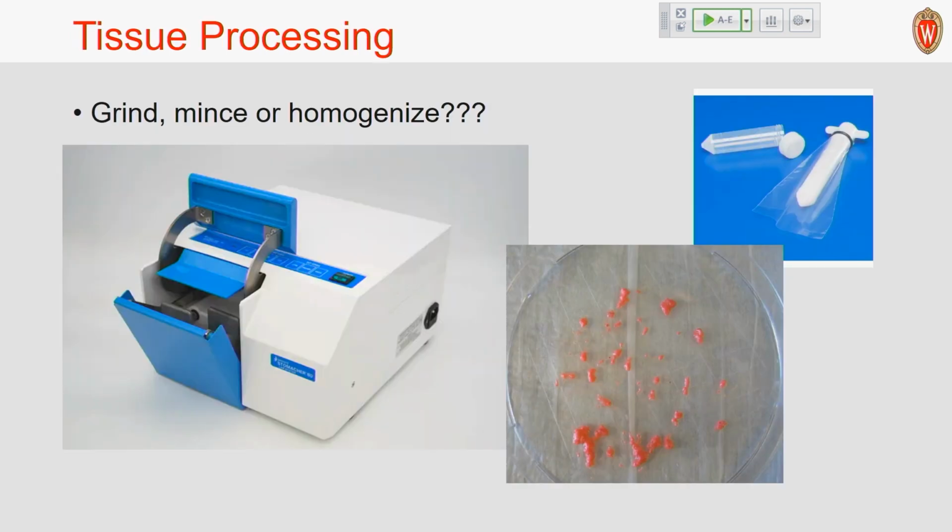Tissue processing. There are several options, and we know with tissues, you just can't plunk it on a plate. Although, as a sidebar, if you're doing a fungal culture, you should always plant a piece of tissue, because filamentous fungi, particularly the aseptate or pauciseptate zygomycetes, don't like to be ground up because they just lose their cytoplasmic contents.